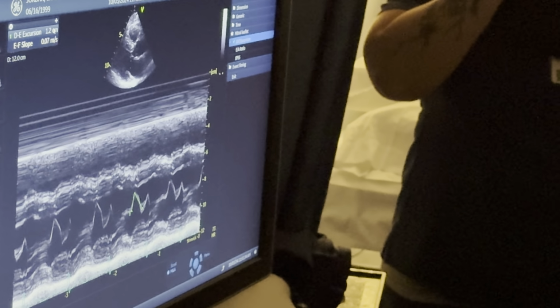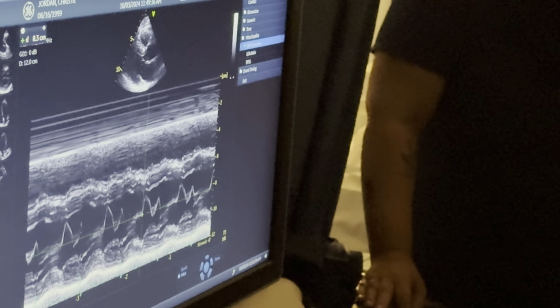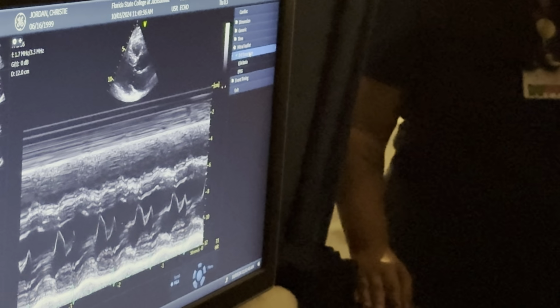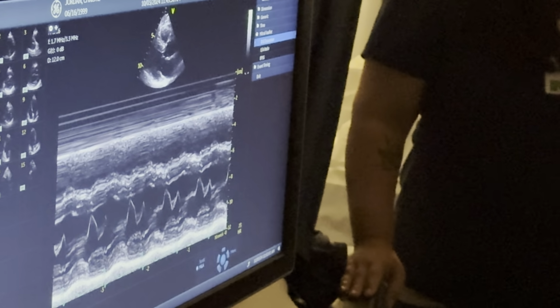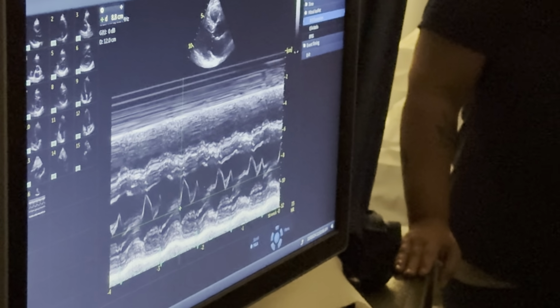You simply go up to this, right click it, and then you're going to delete this measurement, right? It doesn't typically go into the system. We'll have to look at different systems, so you'll have to look. So we'll go into worksheet, and you can see that it didn't take anything, because I'll have a whole bunch of pages of worksheet, but I've only done one measurement here. Therefore it didn't take it. So that's good. So now we're going to do this again.